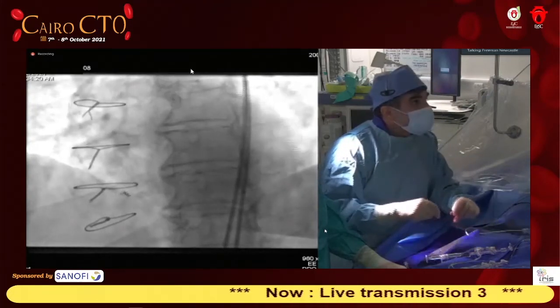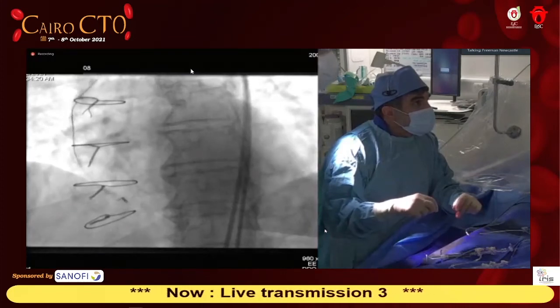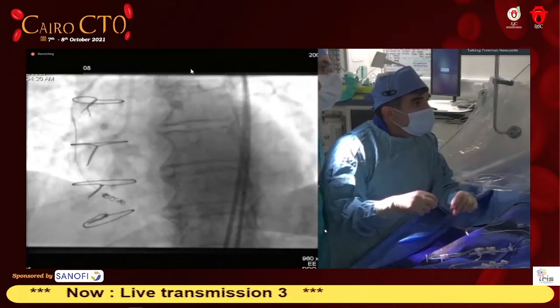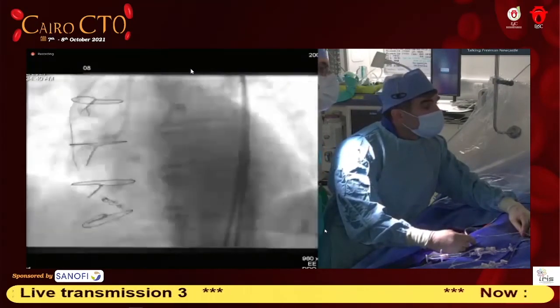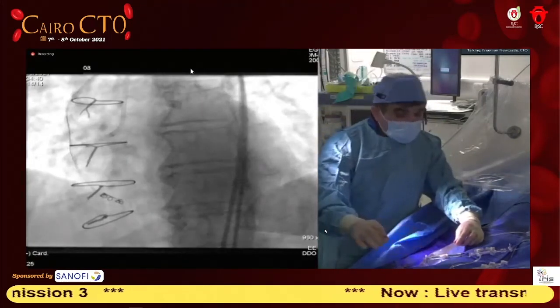So I'm going to bring this back just a nudge. Okay, so just come through here. This is a little bit bigger coil. And you could see it coming through. You could see a little longer, I'm just going to push this quick. Here we go. Oh, yeah. So, did you see the push of the other one? Yes, yeah. Because the other one is recorded.